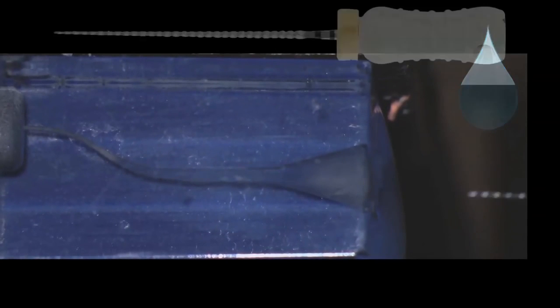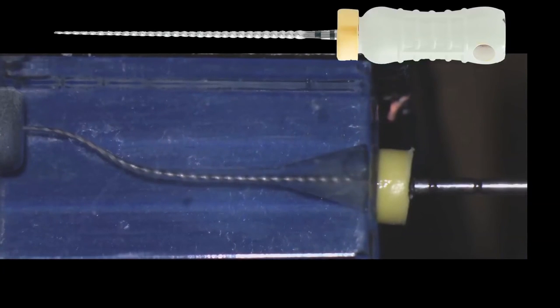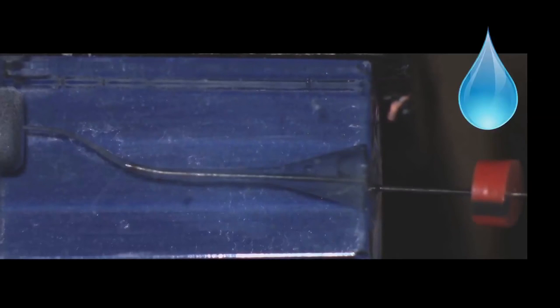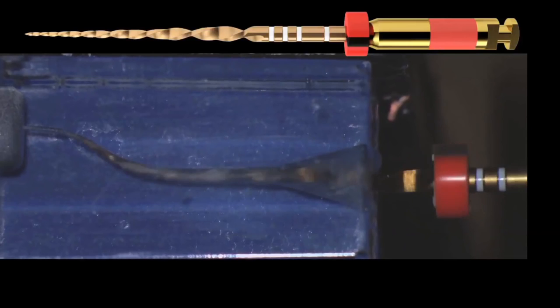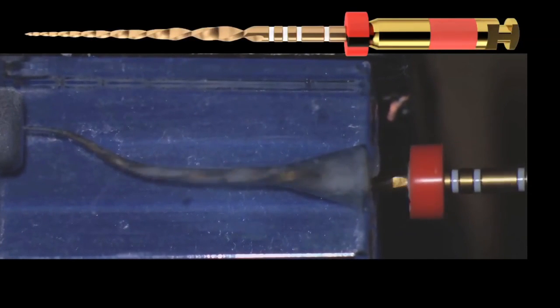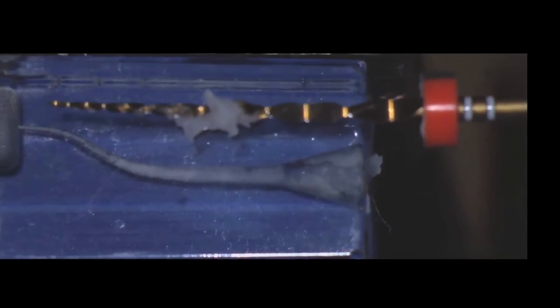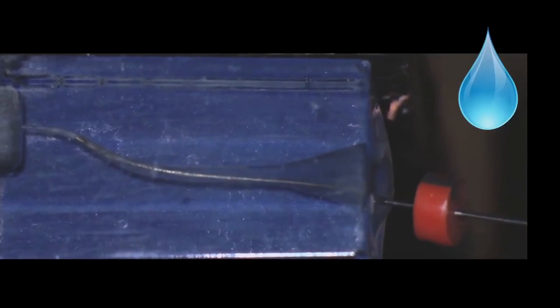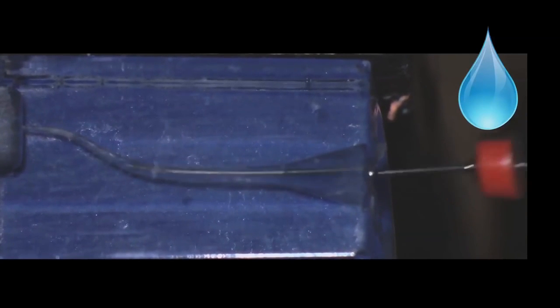check, we will recapitulate, we will be sure that we have not blocked ourselves, and for this purpose we use the file that we established working length with. Irrigate again, and then we go a second time with WaveOne Gold, another 3 to 4 millimeter amplitude strokes. You can see the efficiency of this instrument, how it cuts dentinal walls. We observe the instrument that has the debris. We clean the instrument. We go back now even deeper with our irrigation needle.